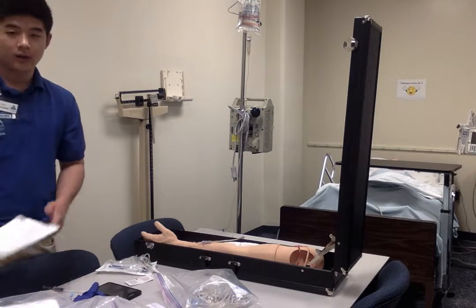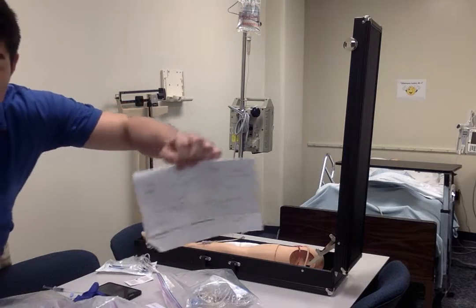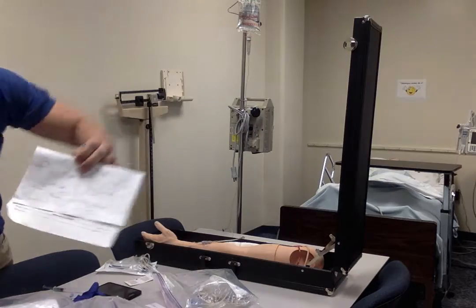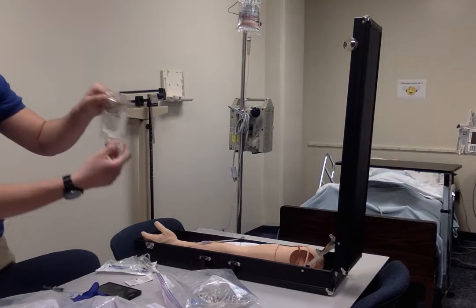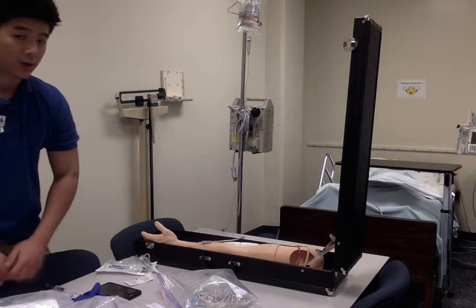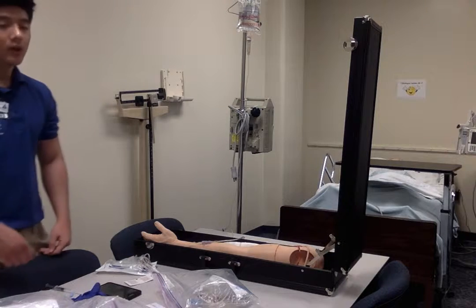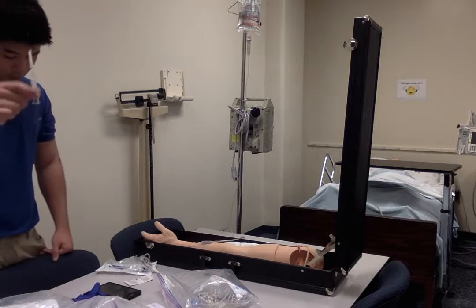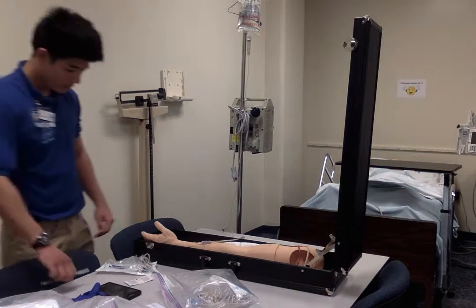I already did that, just for this purpose. And just like the last video, I have already done my IV calculations. So, this is a 50 milliliter bag, but I will assume that this is 100 milliliter. And overall, the doctor's order is 500 milligrams every 6 hours. What I have is 500 milligrams per 2 milliliters. So I drew up 2, and the drops per minute is going to be 1.